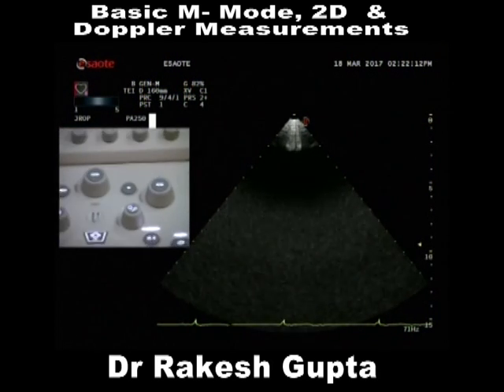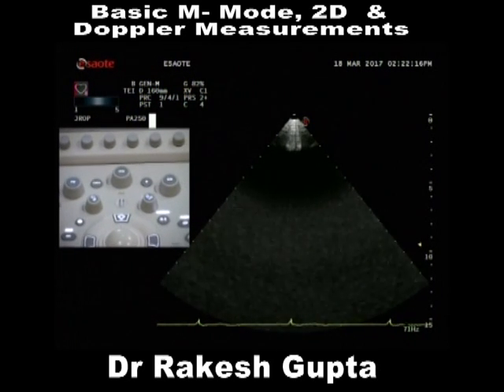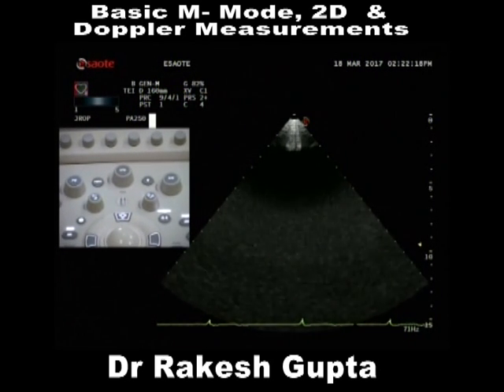On the other side, we have this scale over here. Can you see this scale? This scale is how much? It is 15 centimeter over here. Correct? This is 15 centimeter of depth.